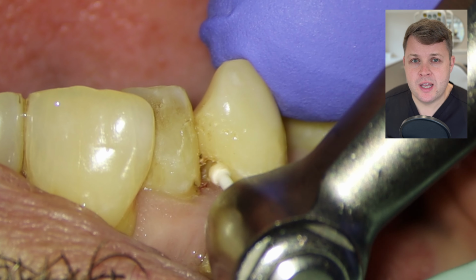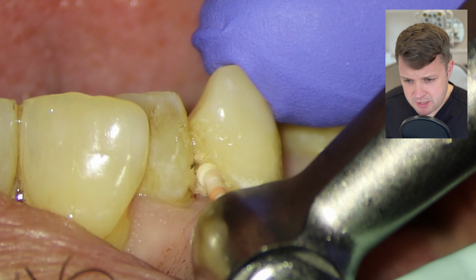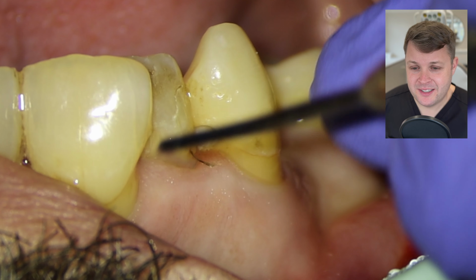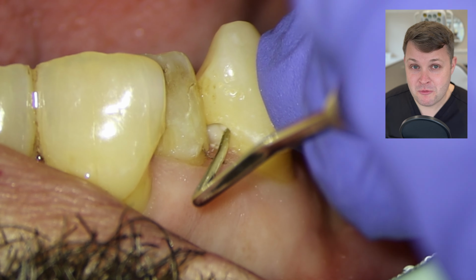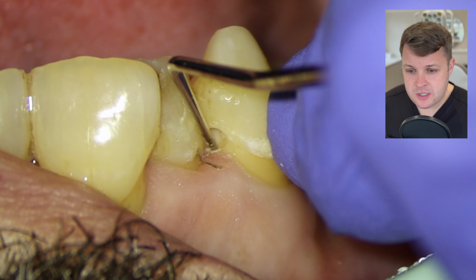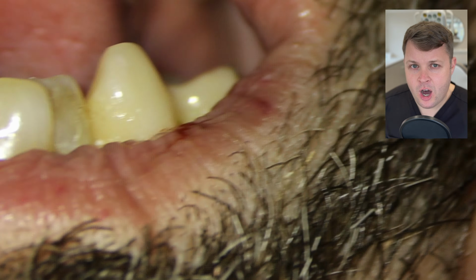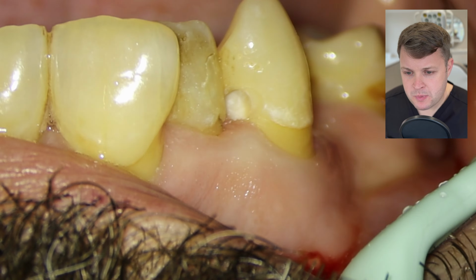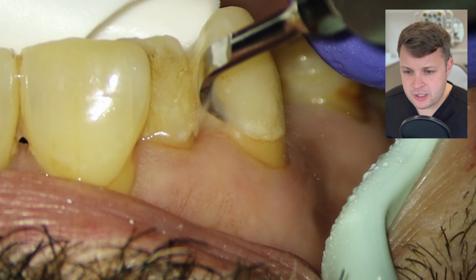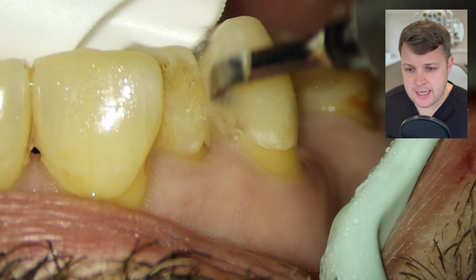So I'm just going to use a slow handpiece here, with a rose head, just to remove some of the decay. And the great thing about these ceramic rose heads is they cut really, really efficiently. And once we remove the decay with the slow handpiece, I'm having to feel around for a breach, but I can't see any obvious pulp exposure. So we're going to do a bit more refinement of the access cavity, have a little feel around, and then what I do is I use an ultrasonic tip.